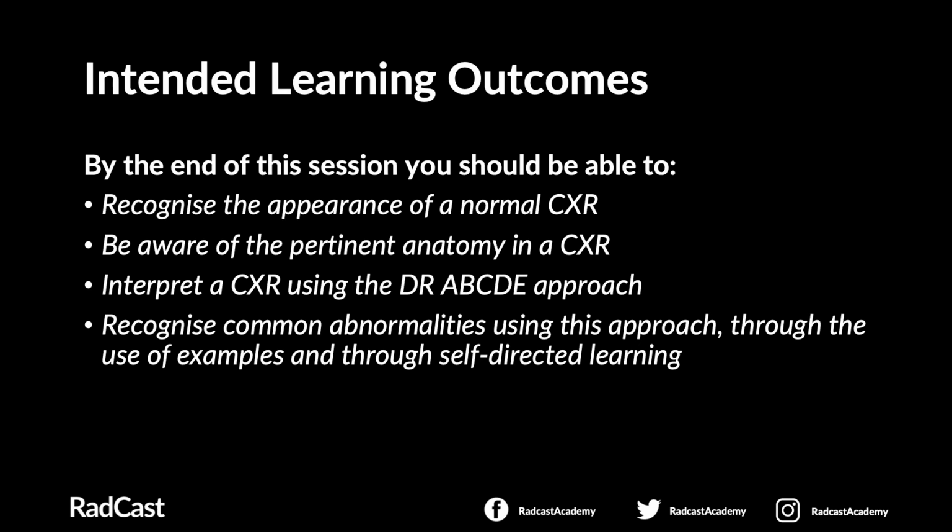So some intended learning outcomes for this presentation include: you should be able to, by the end of this session, recognize the appearance of a normal chest X-ray, be aware of the pertinent anatomy in a chest X-ray, interpret a chest X-ray using the Dr. ABCDE method, and recognize common abnormalities using this approach through the use of examples and through self-directed learning.